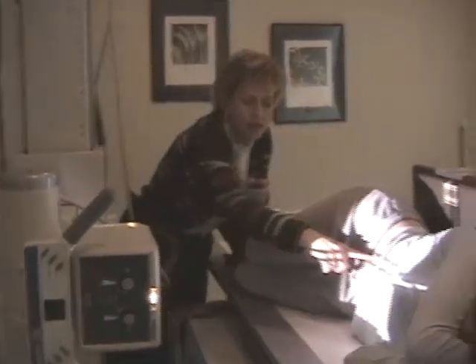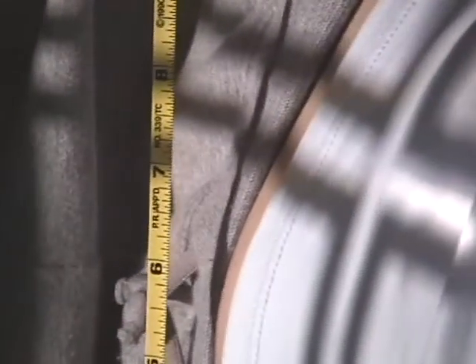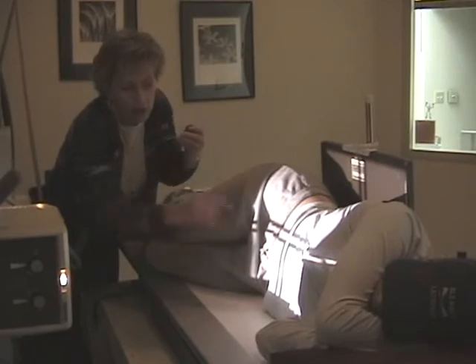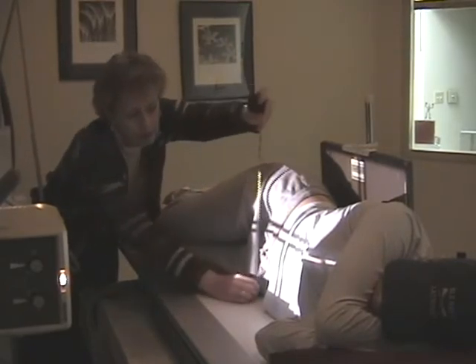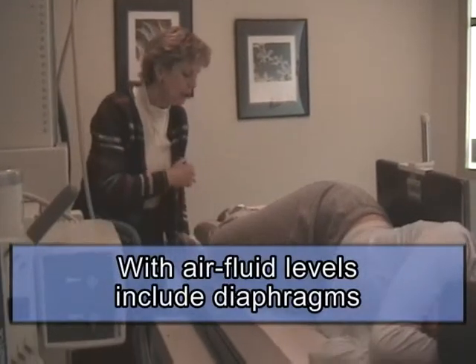And this crosshair here is 7.5 inches up because the grid, the cassette holder is actually, the film is 14 by 17, but the grid itself is actually 15 by 18, and half of 15 is 7.5. So we look at the level of the collimation here, and we have it coming in right across at the 7.5 inches. Okay. If we're after air fluid levels, we want diaphragms included.